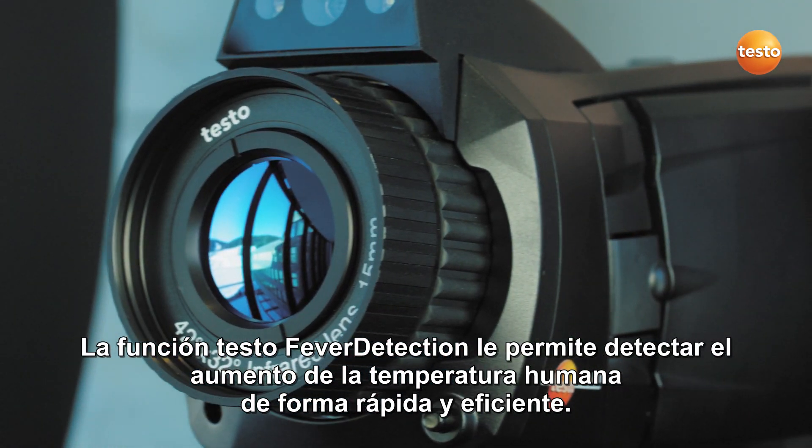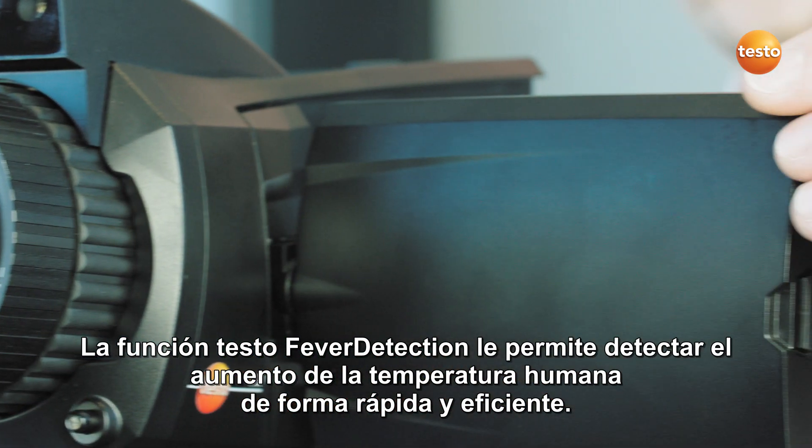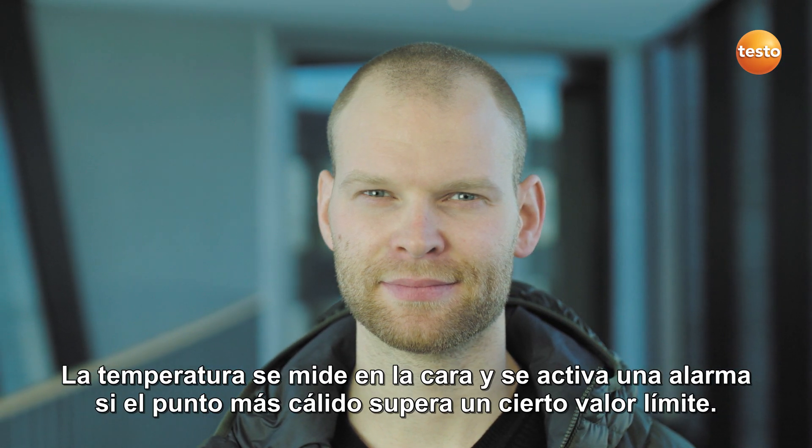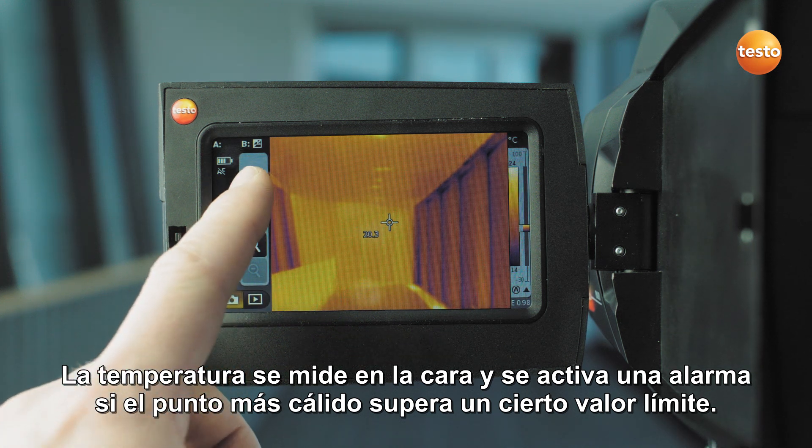The Testo Fever Detection function allows you to detect increased human temperatures quickly and efficiently. The temperature is measured on the face and an alarm is triggered if the warmest spot exceeds a certain limit value.